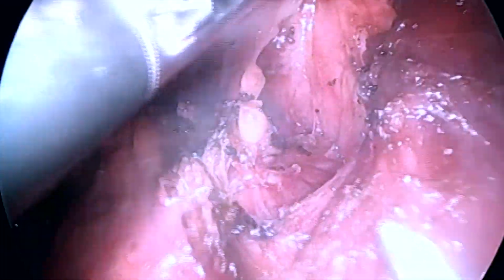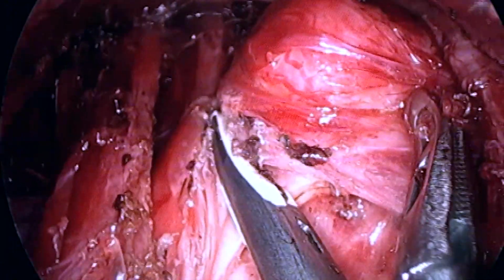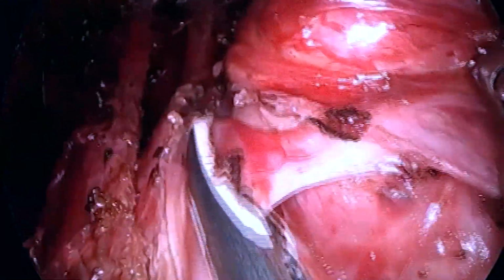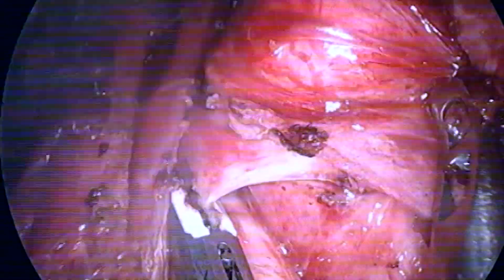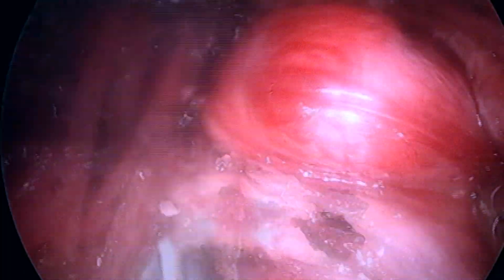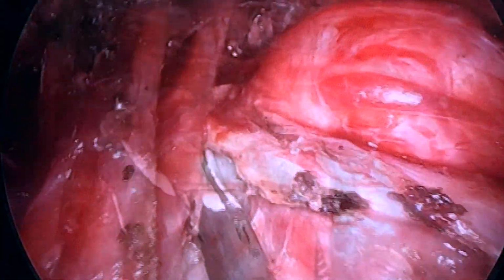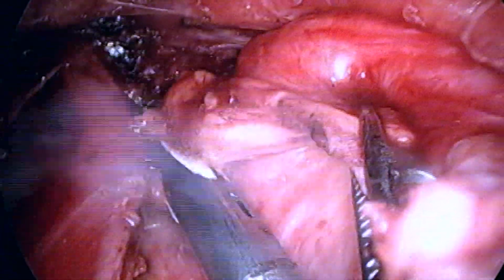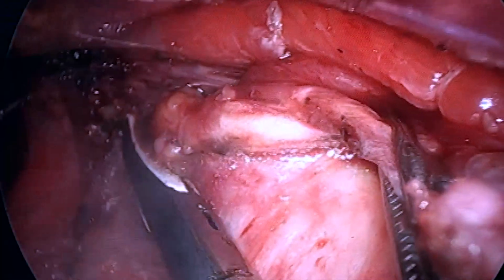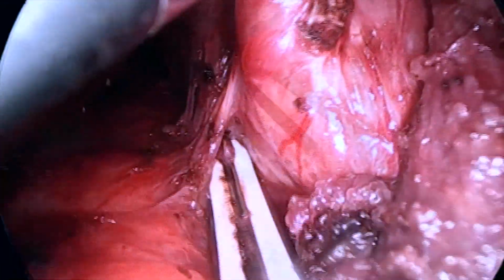Pyramidal lobe, if present, is included with the main specimen. A midline isthmus is exposed and the isthmectomy procedure is completed. The superior release and the medial release of the specimen allow for adequate mobilization of the specimen for further dissection.